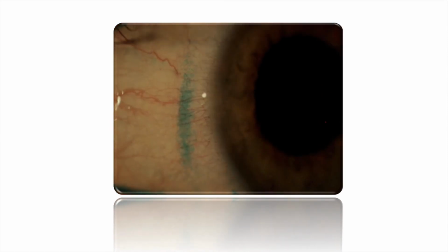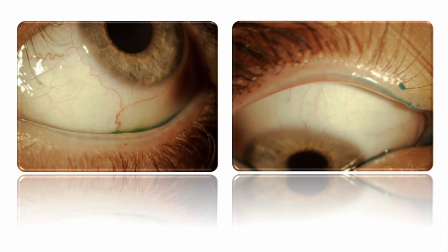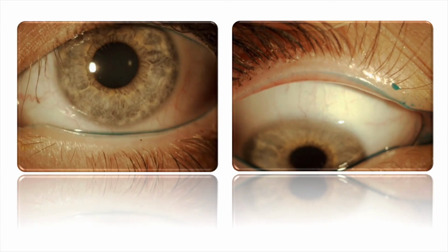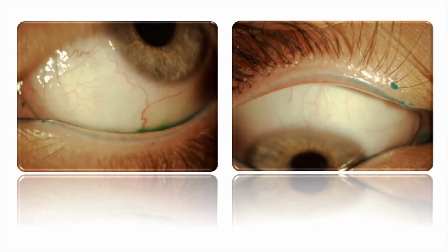Next, we look at the lid margins at an area called Mark's line. It's believed to be the site of contact between the eyelid and the bulbar conjunctiva. We've observed that patients with increased issues of dry eye tend to have a wider area of staining at Mark's line, and this is best observed with Lissamine.